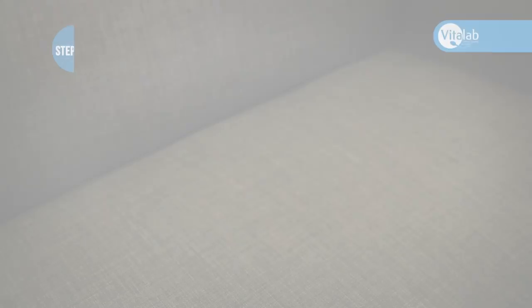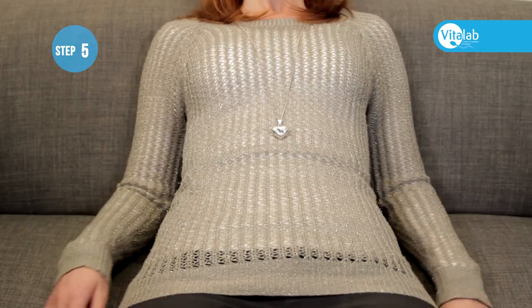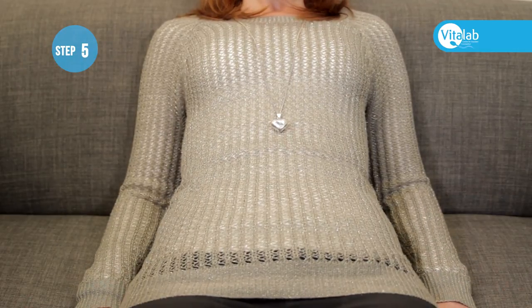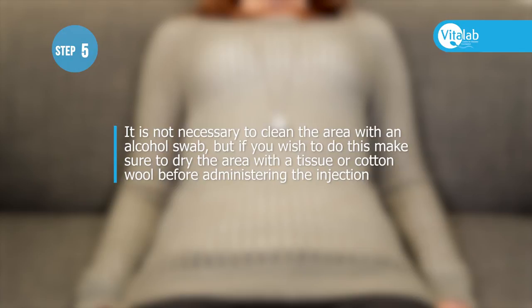The best position for administering an injection is to sit in a chair. Lean back against the chair comfortably. It is not necessary to clean the area with an alcohol swab.